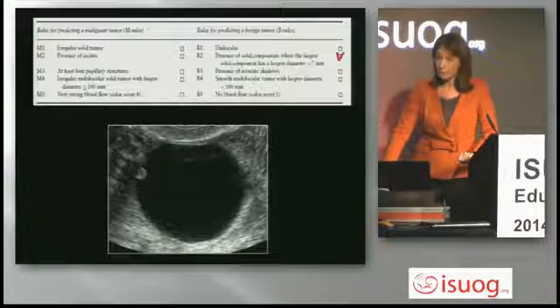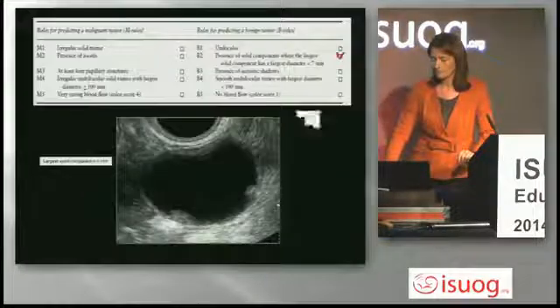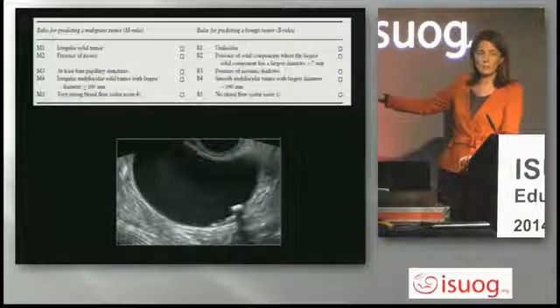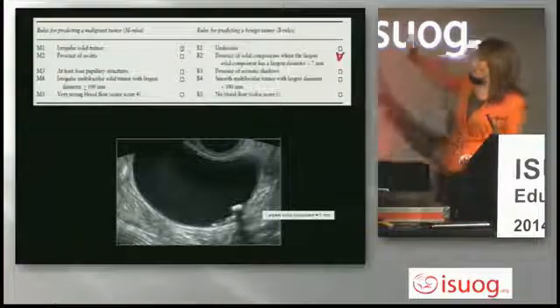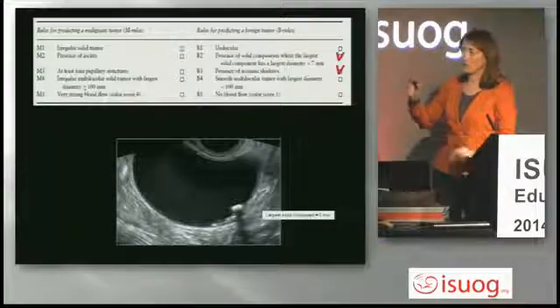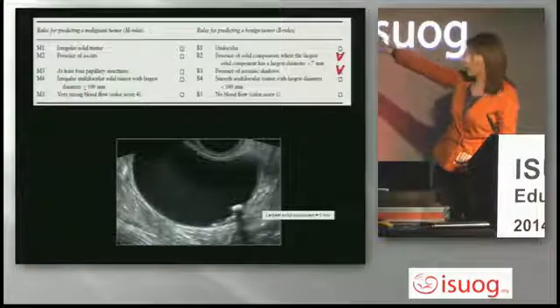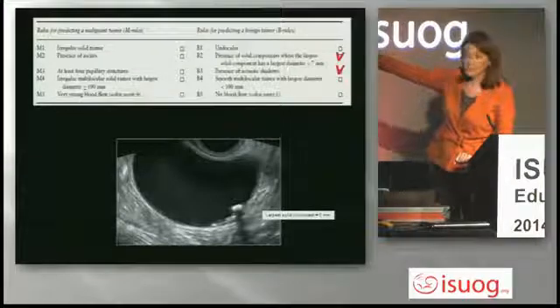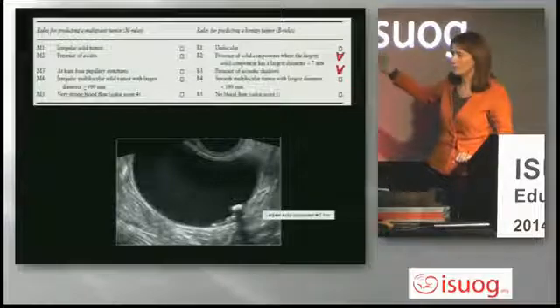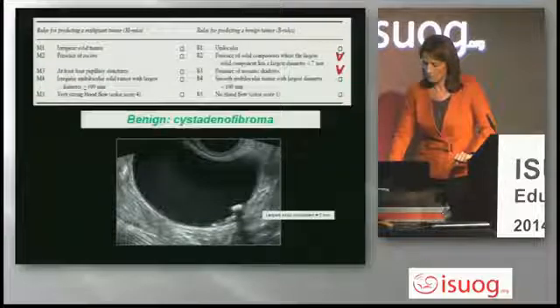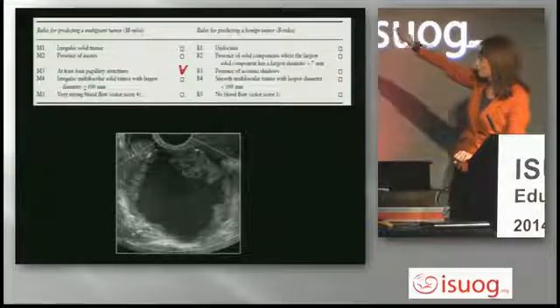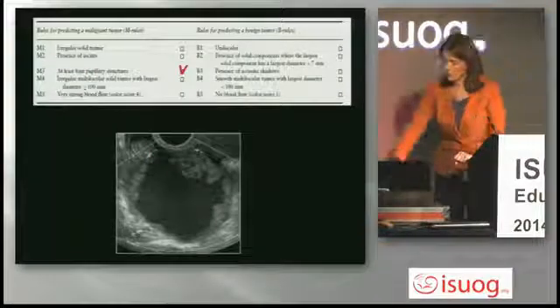Simple rules are really helpful for papillary projections. Pay attention to this one: four millimeters again, with quite evident acoustic shadow. So solid component less than seven millimeters and acoustic shadow both apply. For color score: you can only click if it's color score one or four. If it's two or three, you cannot use the color score at all. With more than four papillary projections and no color score clicked, we apply simple rules — it's malignant.